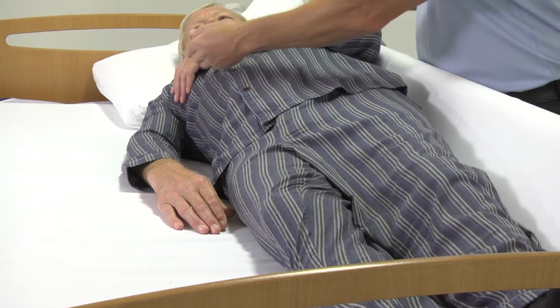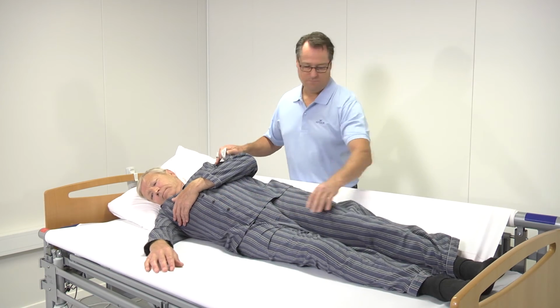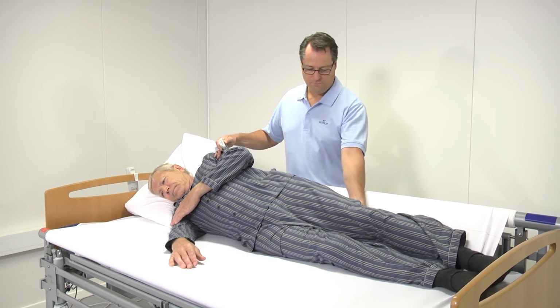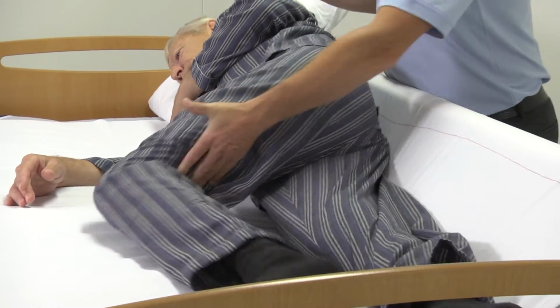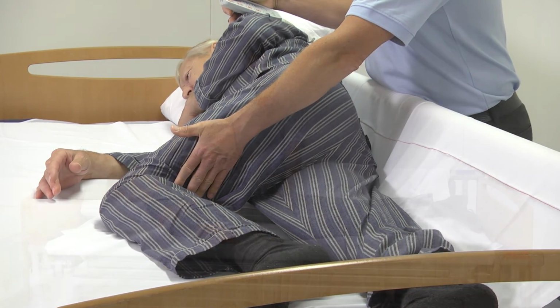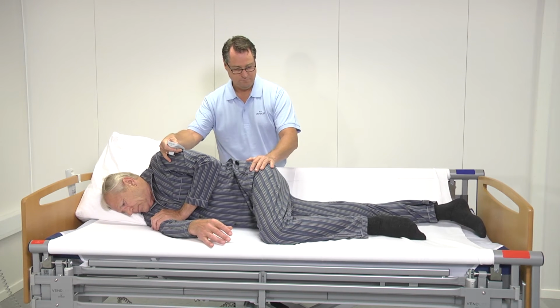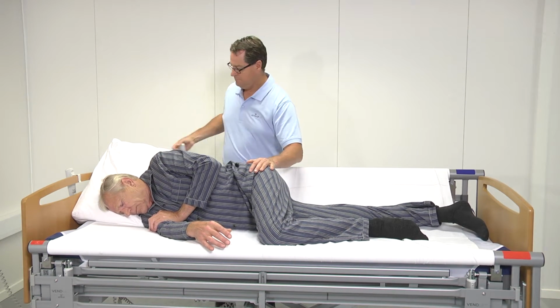Then guide the client's right arm to the side. Move the hand to the hollow side of the client's knee. When the client is lying in a lateral position, move the left leg in parallel over the right leg. Now the client has been turned. Typically, we would position him in the middle of the bed to create a sense of safety.